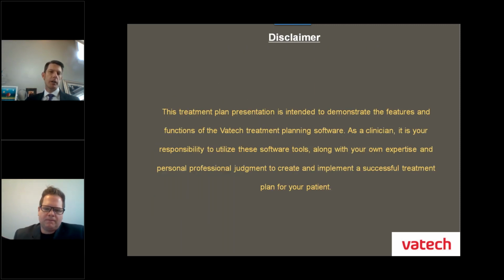Disclaimer: this treatment plan presentation is intended to demonstrate the features and functions of the Vatech treatment software. As a clinician, it's your responsibility to utilize these tools along with your own expertise and professional judgment to create and implement a successful treatment plan for your patients.